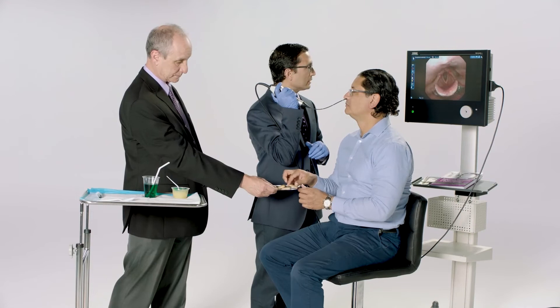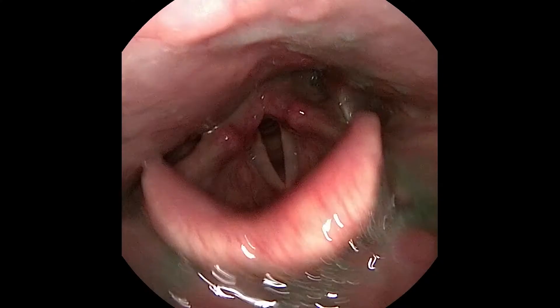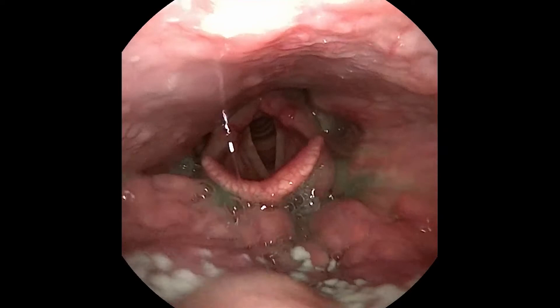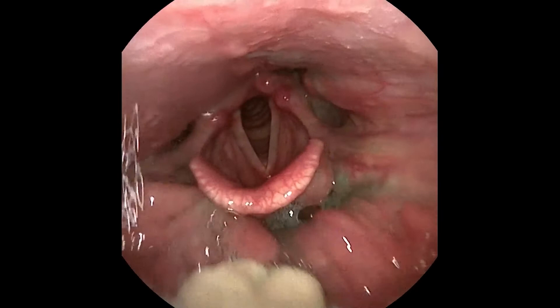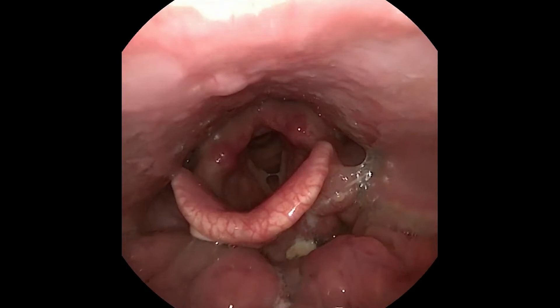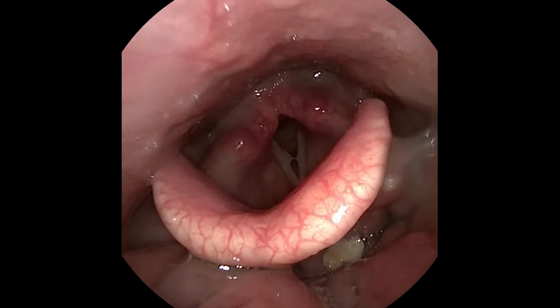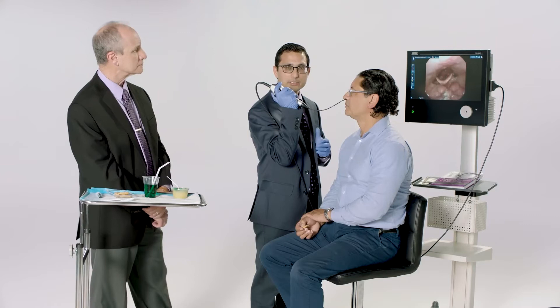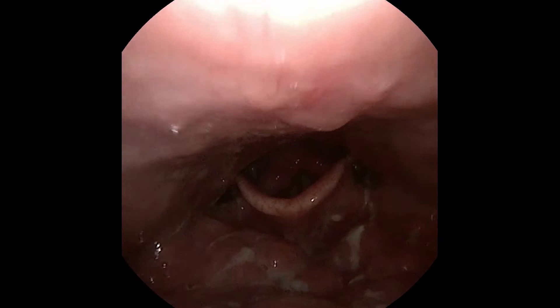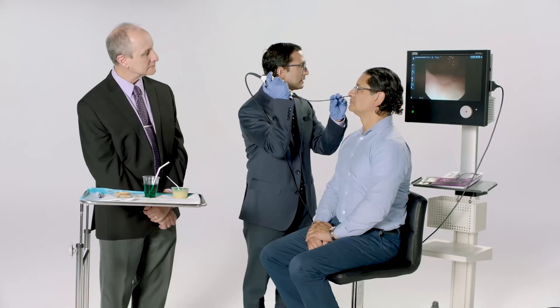We give the patient a small cookie to bite. While the patient is chewing, you can get a sense of what's happening in the oral cavity by how long it takes for the bolus to be swallowed, and if there are abnormalities like premature spillage, penetration, or aspiration before the swallow. After the swallow, we look again for residue — there is minimal residue in the vallecula — and again look for penetration and aspiration. After swallowing is done, if there are abnormalities, we can perform compensatory maneuvers to see if swallowing can be improved. Then remove the scope atraumatically.